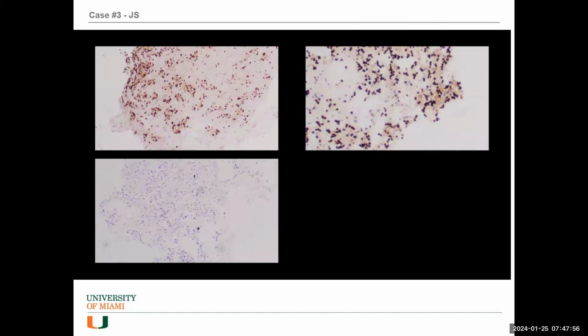Okay, it was described in the fourth ventricle first, and there's an overlap of this morphology with DNET, which typically occurs in the temporal lobe, and also sometimes what we call PLNTY, pleomorphic neuroepithelial tumor of the young. So these revolve around FGFR mutations, and they are generally grade 1 tumors. So grade 1 tumor, most likely rosette-forming glioneuronal tumor, and needs NGS. I don't think it's back yet, but that's where we are.